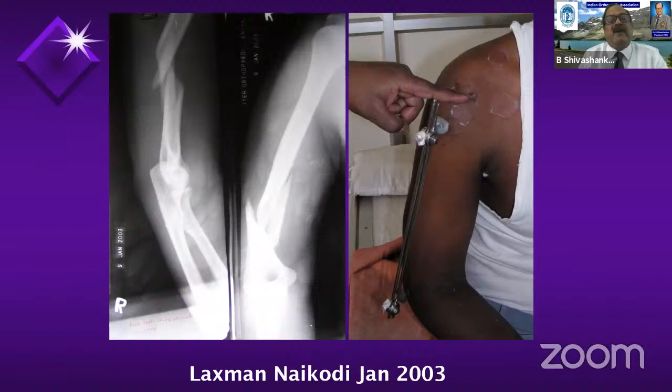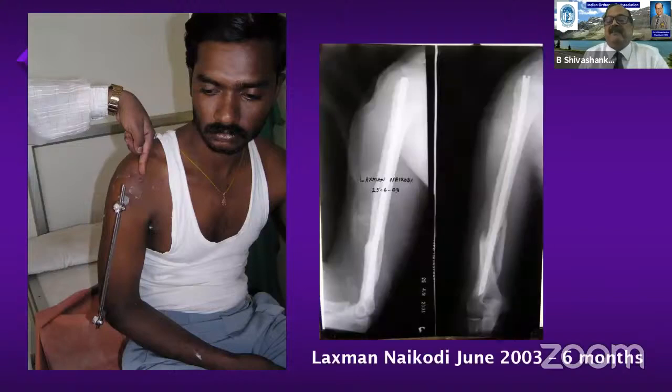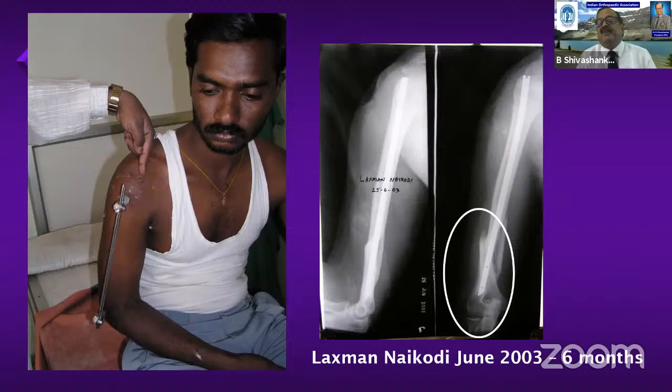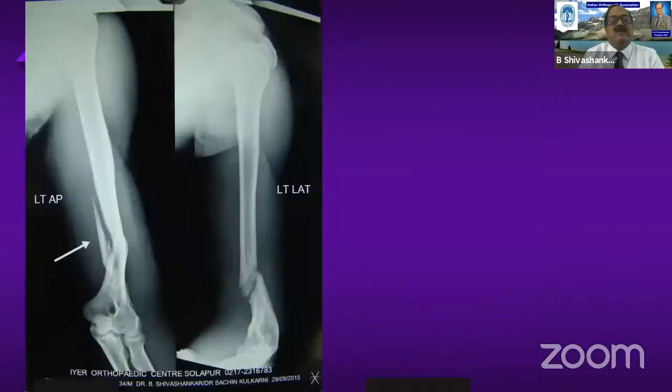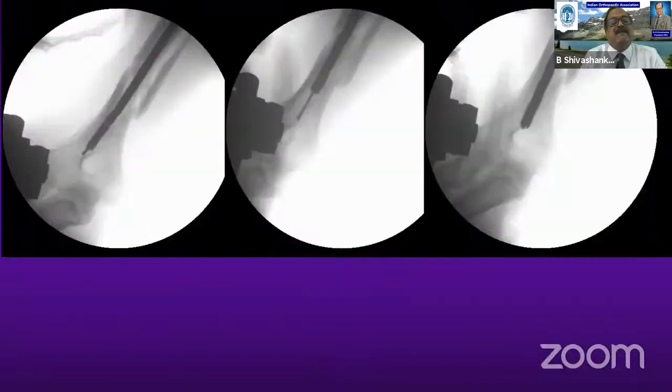Again, this young boy, because of the combination, I thought let me do an external fixator as a hybrid fixation. This is after the implants have been removed. Unfortunately, though clinically it was not very significant, you can see there is a varus happening at the fracture site, because the problem is that the nail enters the lateral condyle easily. So nowadays what I do when I take this case is I open up the olecranon fossa and push the nail in through the olecranon fossa, as you can see in this case. So the nail is passed through the olecranon fossa after opening up the fossa. Here you can see my guide wire is going to the lateral cortex.